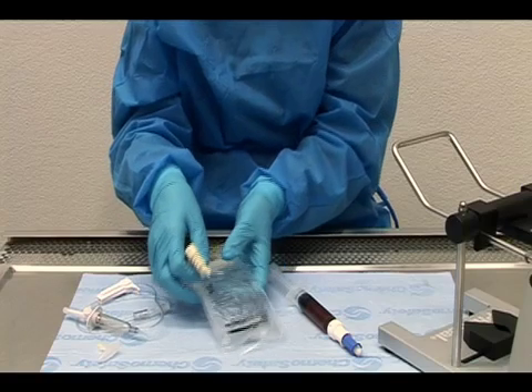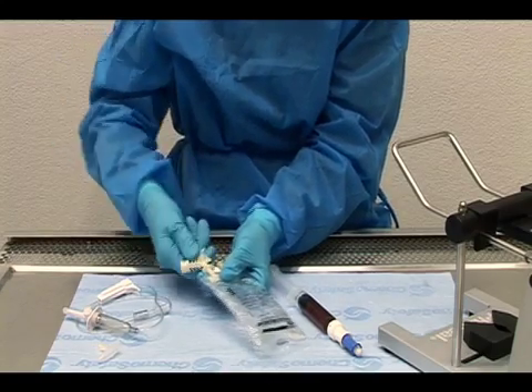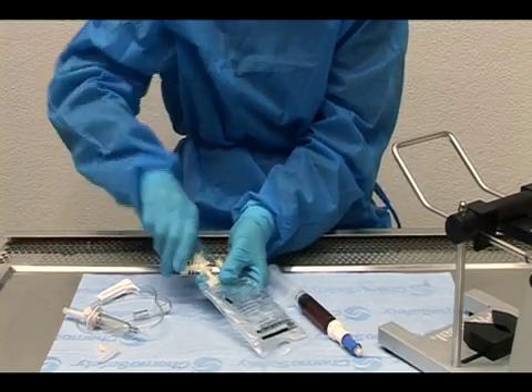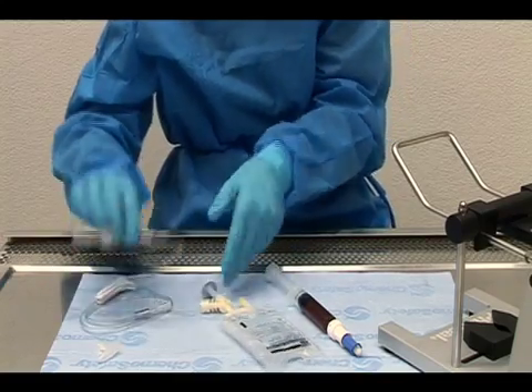IV bag preparation with spiking and priming in pharmacy. On a flat surface, spike the IV bag with the infusion adapter. Make sure the spike is pushed in over the bottom ridge or shoulder of the adapter.